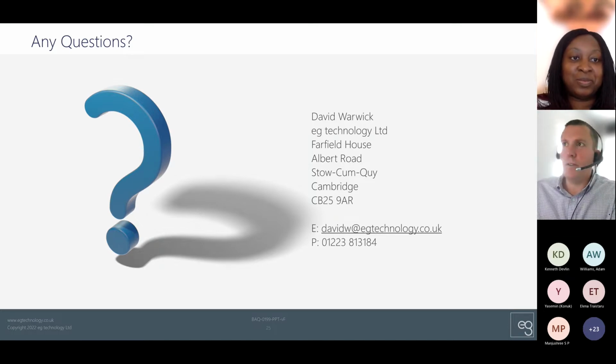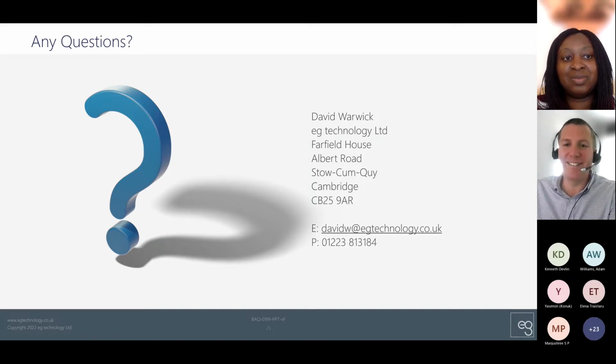Well, on AWS, I'm not sure what their latest uptime is, but it's astonishingly high. It's almost perfect. It's going to depend on the nature of the risks of the system. So that's what you need to be thinking about. So it falls back on things like my ventilator analogy. I mean, if AWS is keeping a ventilator alive, has AWS and the connection to AWS got good enough, sufficiently guaranteed uptime, that you're happy with it.